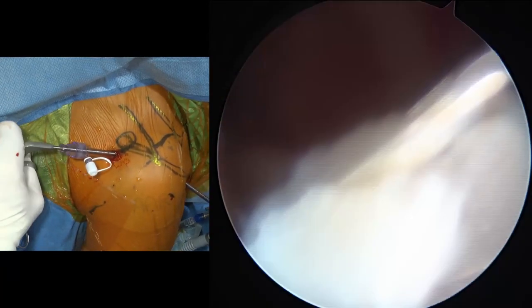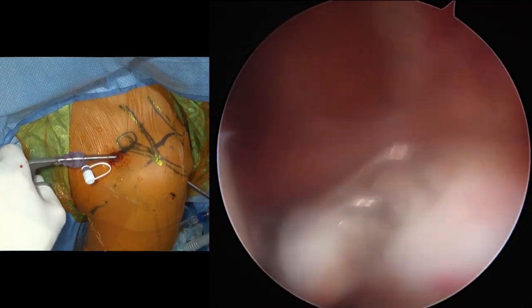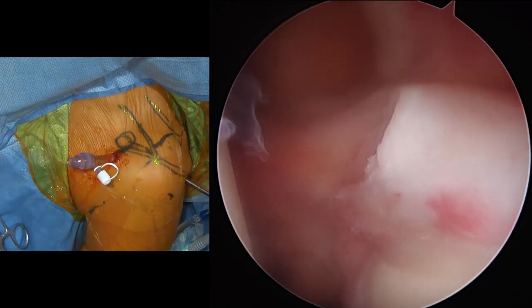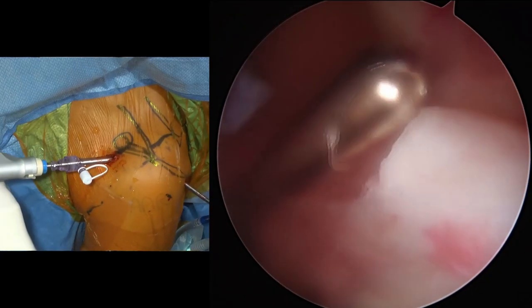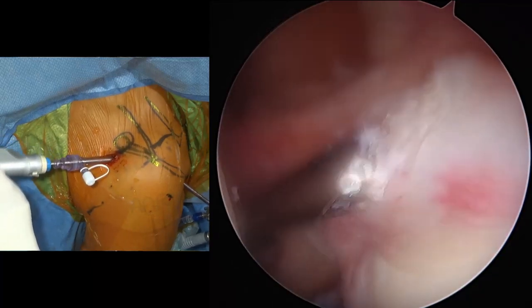And our last little bite here, hopefully. Shaver, please. And then we'll have the arthrocare coming up next. Okay, arthrocare.